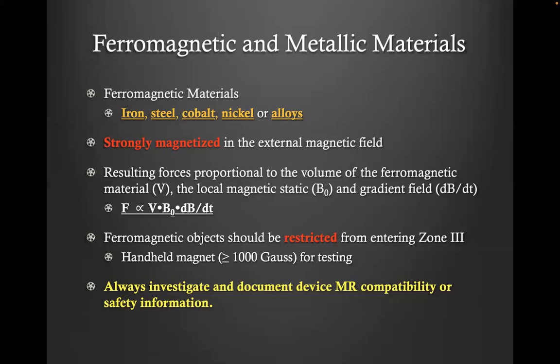And sorry. So we have a handheld magnet, and if you are unsure, you can come to see us, and you can use the handheld magnet to test if there's any magnet there. So you should always investigate and document device compatibility and safety information.